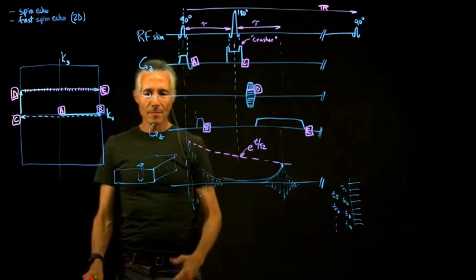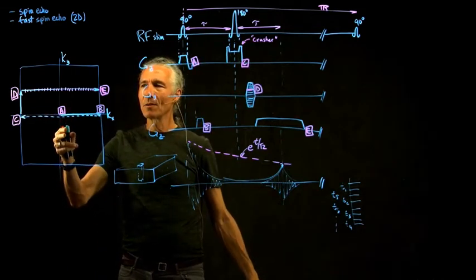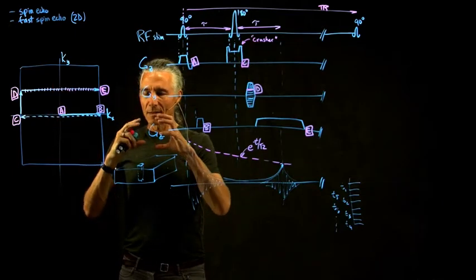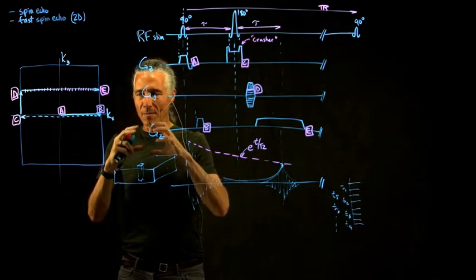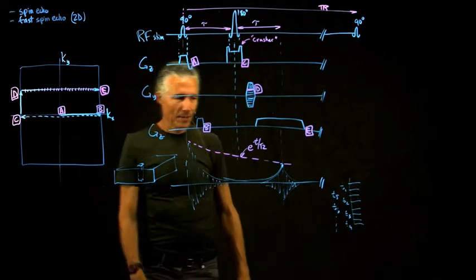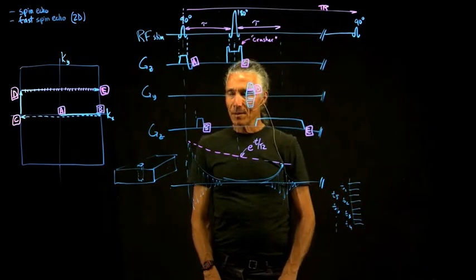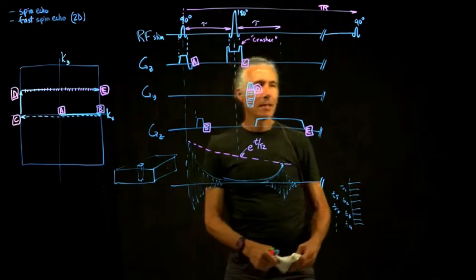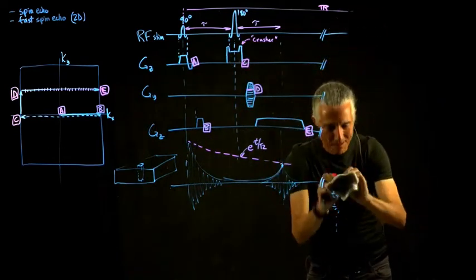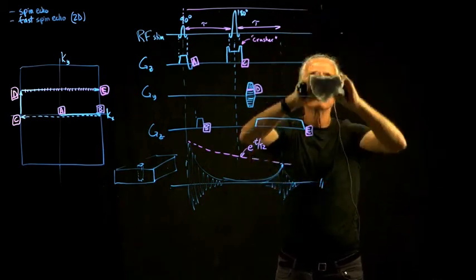And then the other problem is the movement artifact, because you're collecting these lines of K-space over time, and so you don't really reconstruct the whole image until you get to the end. So the movement artifact can occur anywhere in that 40 minutes, and that's obviously going to end up with very bad looking images if there's any movement. And there's no easy way to correct that. Like when I started out, we did scans just like this that were really slow.